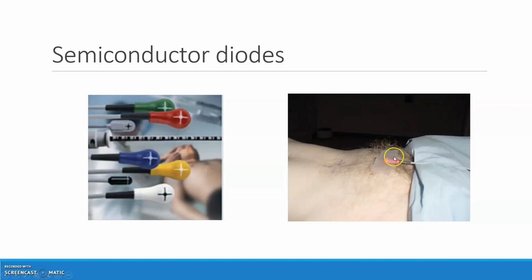In this case, it's quite likely that this will spring away because it's on these tubes here, move closer to the source of radiation and give you a higher dose than expected. And you think, oh, that's not right, wonder what's gone on. You go in, you find out that's what's happened, the tape's come off, it's moved closer to the source and has ended up with a higher than expected dose. And you can go, well, that's absolutely fine. It's an error in dose measurement, not in dose delivery.